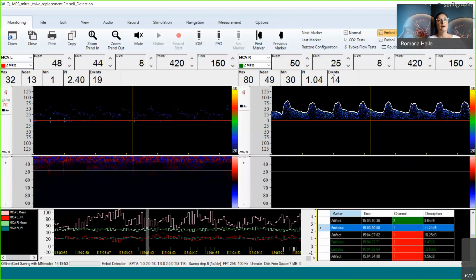Here, it will automatically increase the number. So let's change it back to artifact. If you rename it to an artifact, then it will give a lower number back. So this will always be updated.